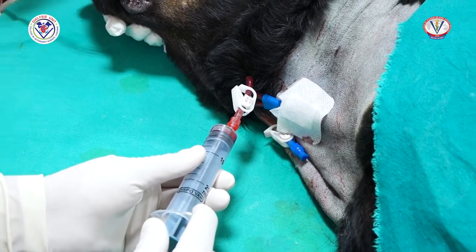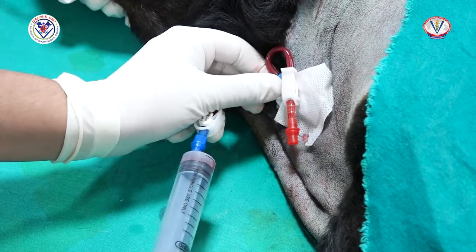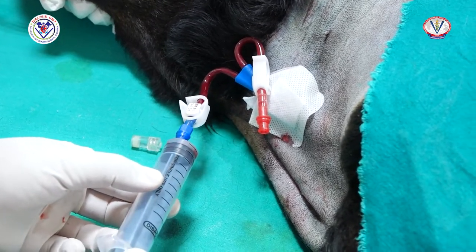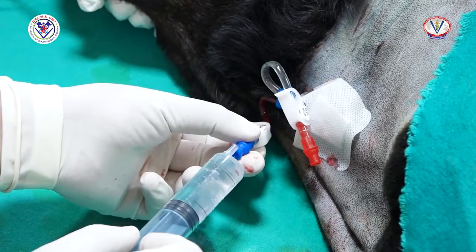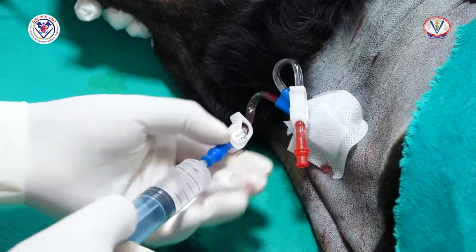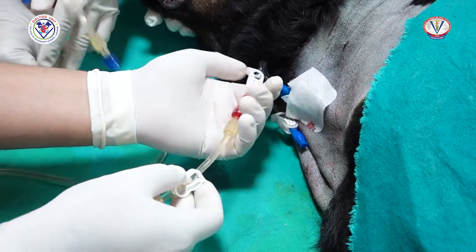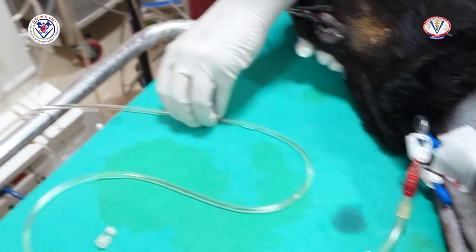Before connecting the blood tubing to the patient, always check the blood flow through both the catheter ports for any resistance. If resistance is felt, flush the catheter with normal saline solution. After this, connect the arterial line with the arterial port of the catheter and unlock all of the clamps.